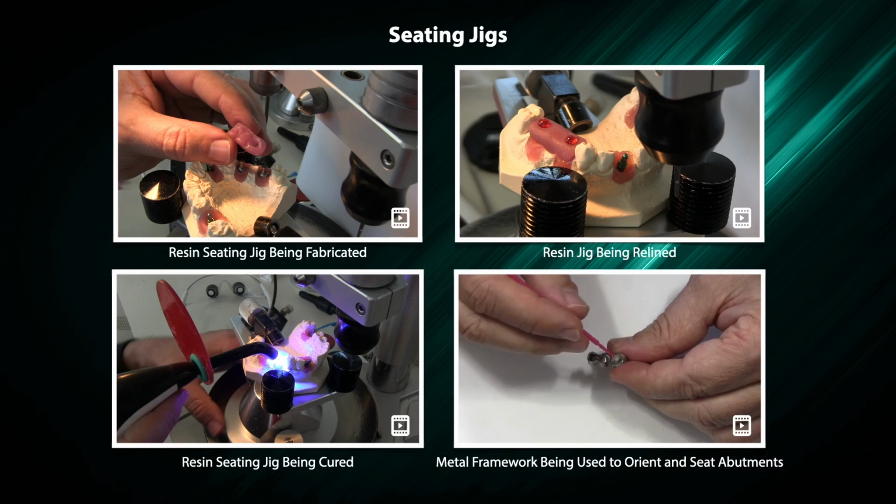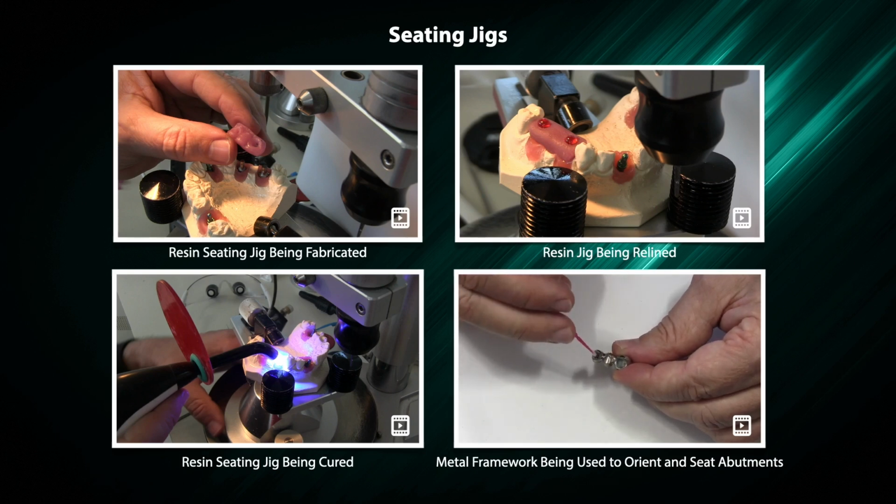Metal framework being used to orient and seat abutments.